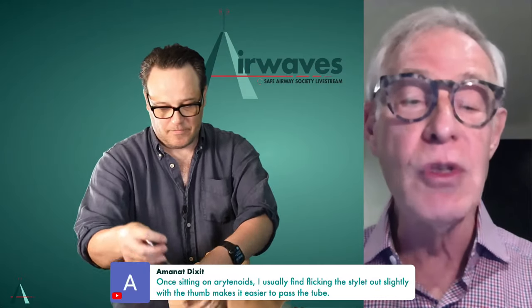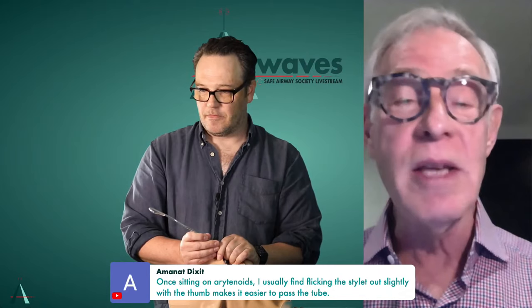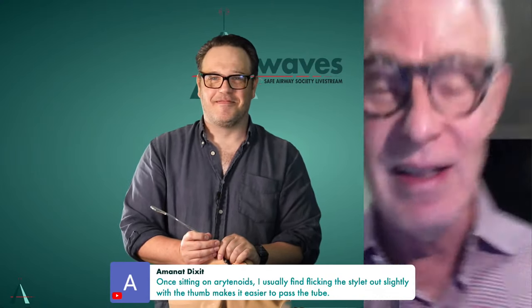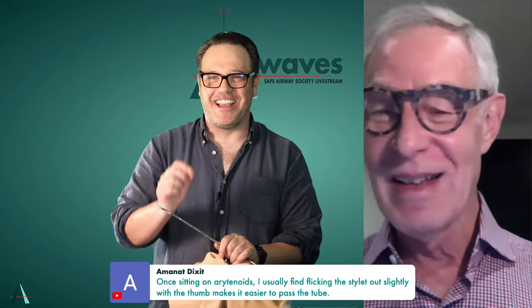Well, as I said, I use mostly the Mallinckrodt satin slip malleable stylet, and I haven't found it necessary to lubricate the stylet. I think if you're using the rigid GlideRite, then it may very well be helpful. And I take anything I hear from John Sakles with significant consideration. He's a man of few words, but they're high yield words.